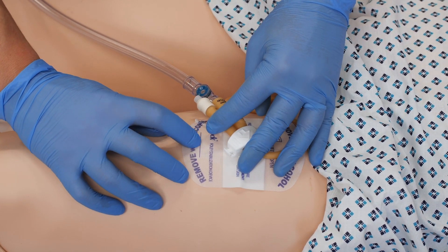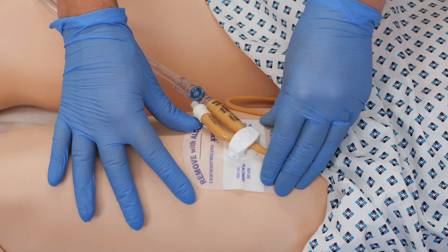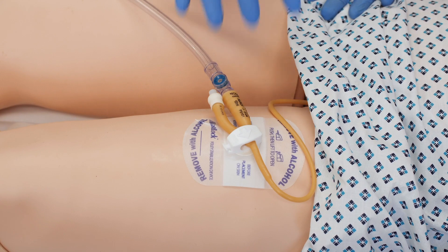There's a section here where you can put the date on that the device was applied. These can stay in place for several days unless they obviously become soiled or come away. You can also use them on alternative legs.